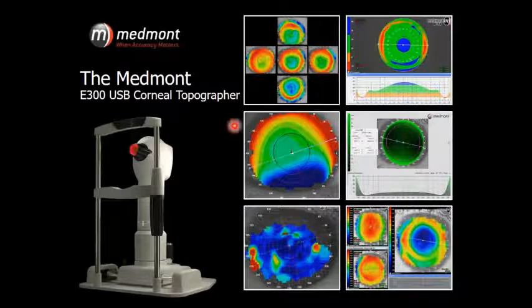And what we can see on the graph is the blink would be along this meridian here, and then right after the blink, the video begins. And we see the tear film is relatively stable for about 3.2 seconds. Then the tear film begins to break up, and there is a definitive breakup time at around 5 seconds.